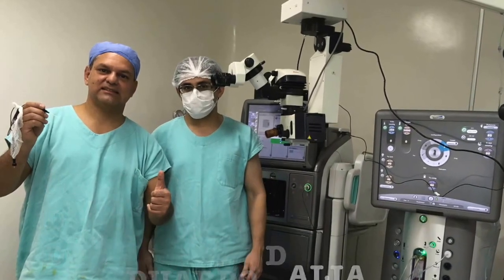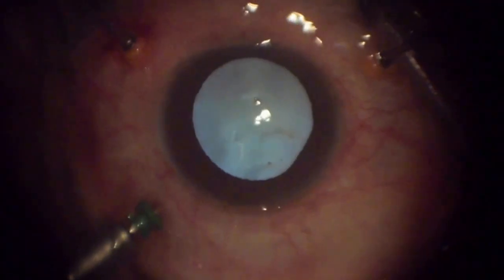This is a retinal case, it's a retinal detachment with PVR. As you see, you see subretinal PVR together with anterior PVR. We are doing core vitrectomy by now using this quadrospheric wide-angle contact lens.